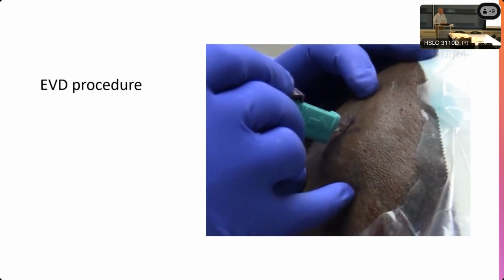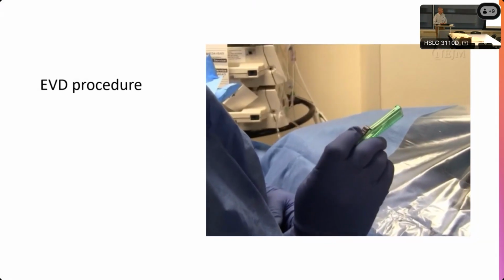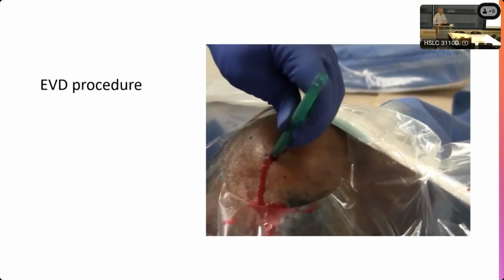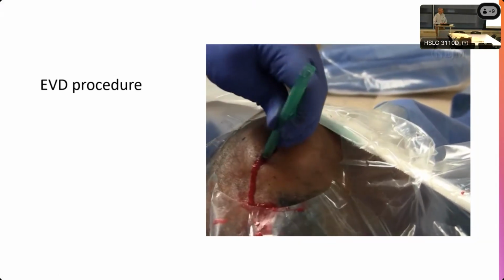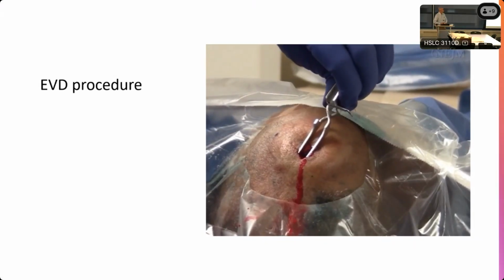Using the scalpel with the number 15 blade, make an incision down to the bone. Secure the scalpel blade and scrape the pericranium using the handle of the scalpel. Use the retractor to hold the edges of skin open.